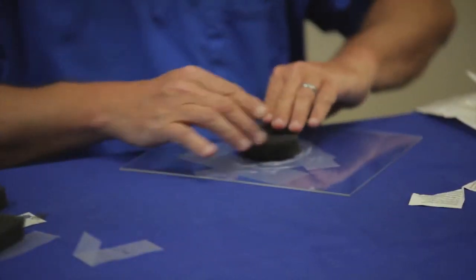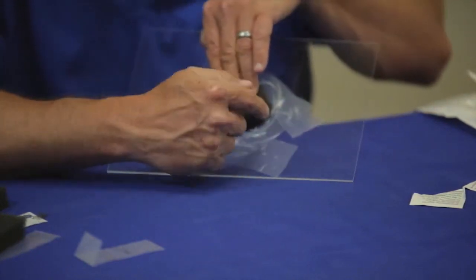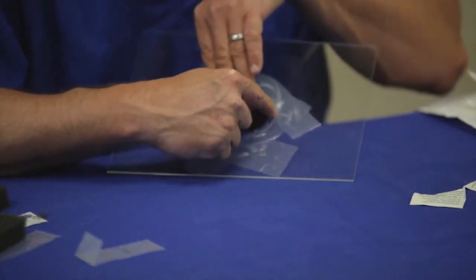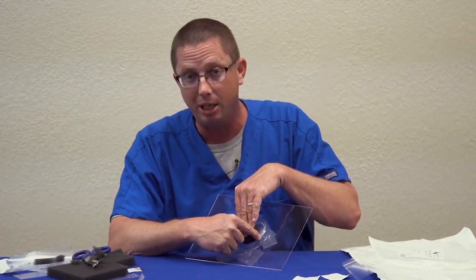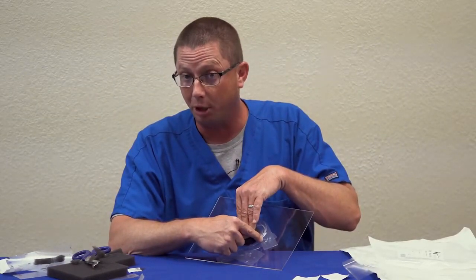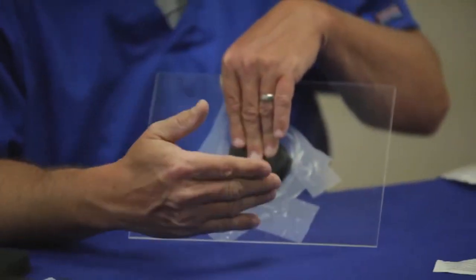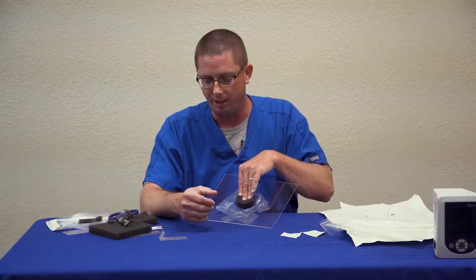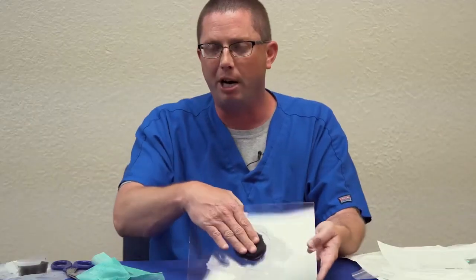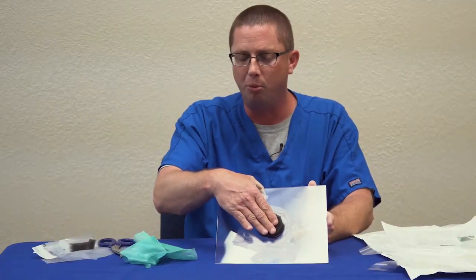And as you can see, I've cut that to fit my wound. In case any foam does come out here on the peri-wound area and touches intact skin, it will not cause any damage to that peri-wound area. Again, one of the basic principles of negative pressure wound therapy is foam cannot touch intact skin. From here, we need to cover the wound base. We need to seal the wound base.